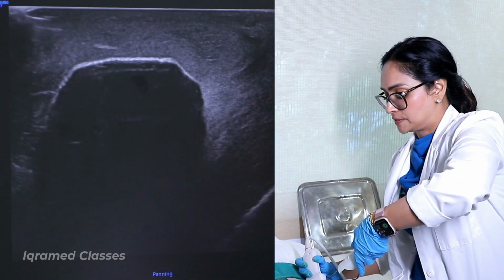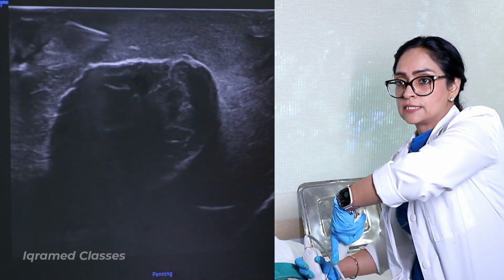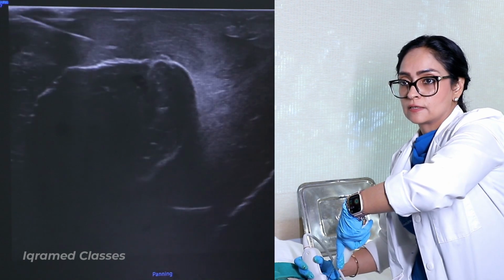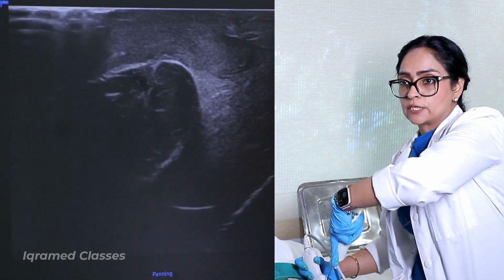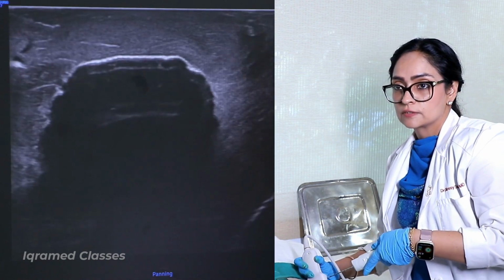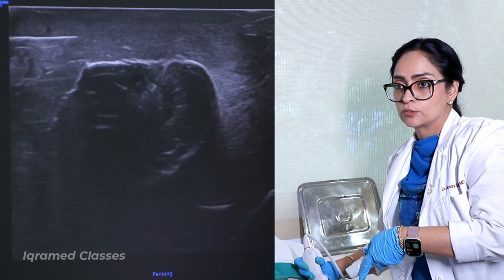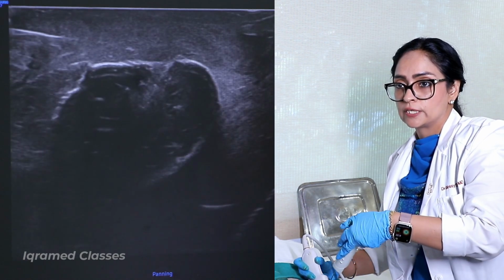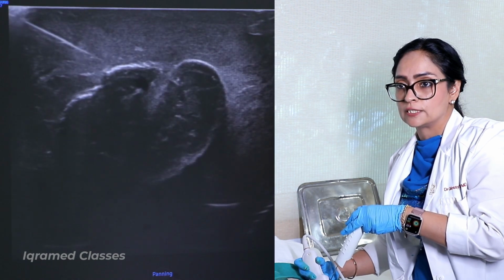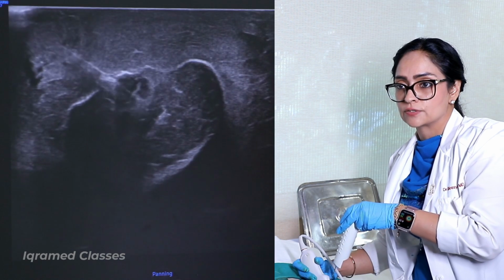This is our biopsy gun, as we have shown you before. This is our biopsy gun. You can see it well. This is the gun that's going inside the lesion. This is the solid mass. We keep it parallel to the probe, doing a slight maneuver, oblique, anterior, posterior, depending on the lesion, and we can see that it has gone inside the lesion.